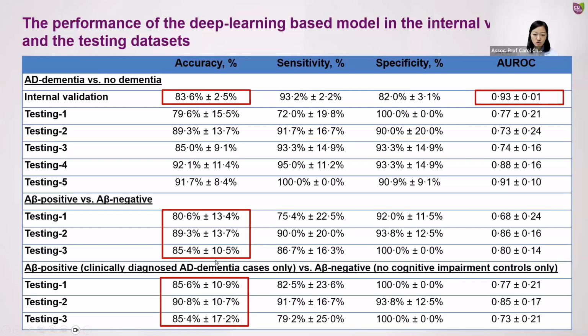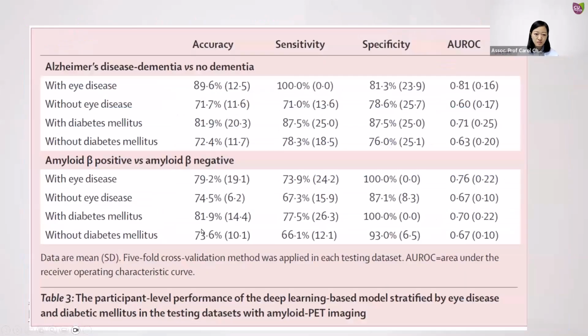Our work demonstrates that deep learning has great potential to discriminate AD-related retinal changes from cognitively normal controls. To increase the applicability, we intentionally included retinal photographs with concomitant eye disease in the training datasets because age-associated eye conditions are common in people older than 60 years. Meanwhile, excluding eyes with this condition might also introduce selection bias.